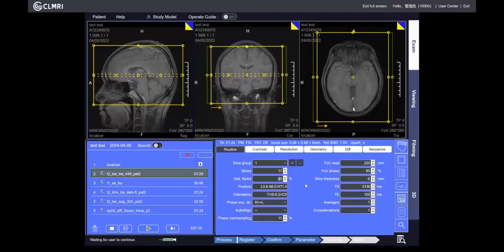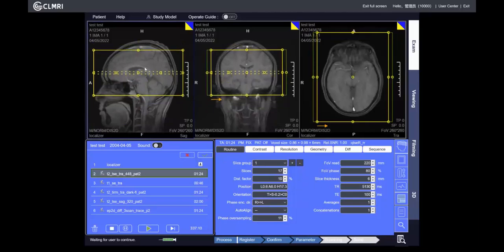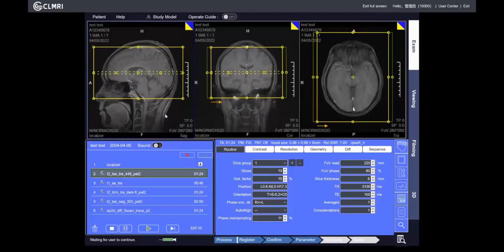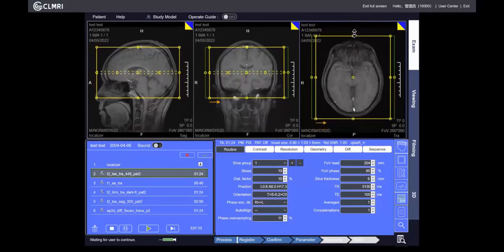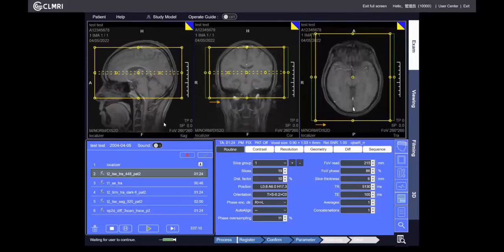The distance factor is not correct — usually we input 10% or 20%. All parameters can be changed by clicking the up or down button, or you can input a number directly, or by pulling the boundary of the scan plane. The scan time is currently 1 minute 24 seconds. We can change TR — the time of repetition — and the scan time will update accordingly.